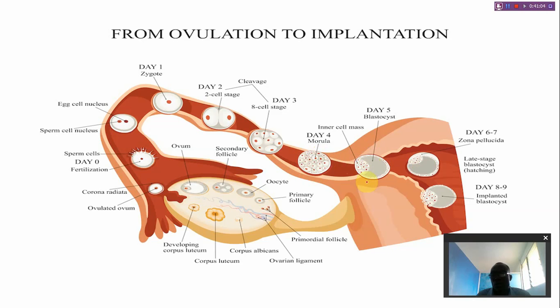Sometimes when there's no separation, they come as one blastocyst. The blastocyst is the sac that comes into the uterus before the baby develops. Normally the embryo is attached to the wall of that blastocyst, and what appears mostly first is the yolk sac. So the yolk sac will normally appear before the baby. The baby is always attached to the yolk sac.